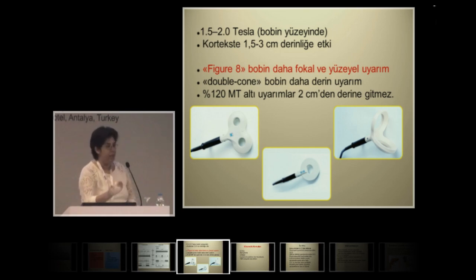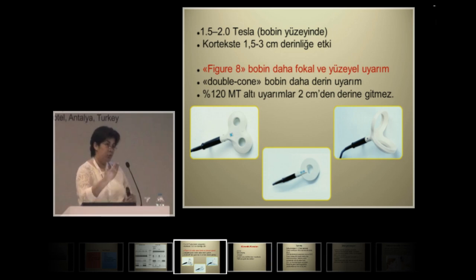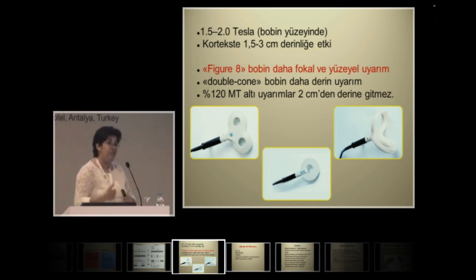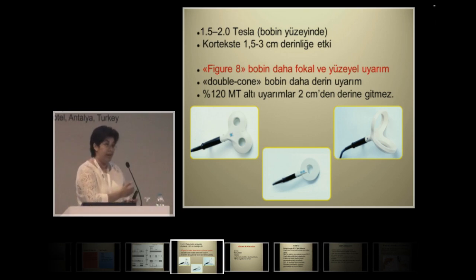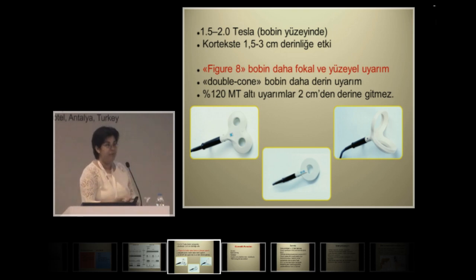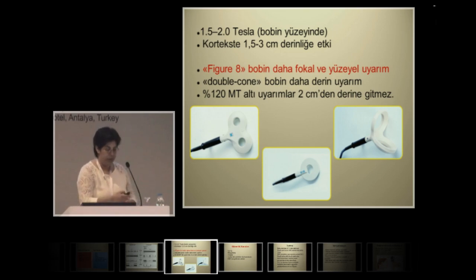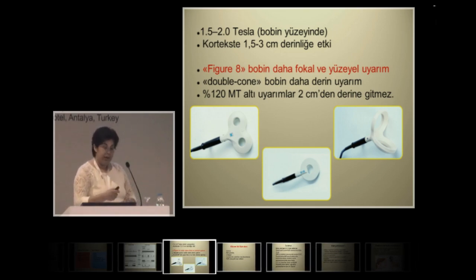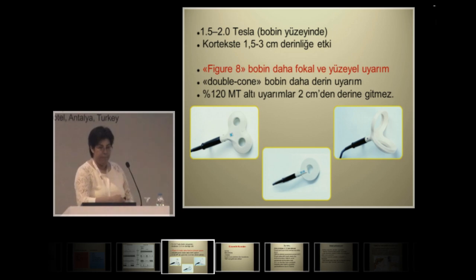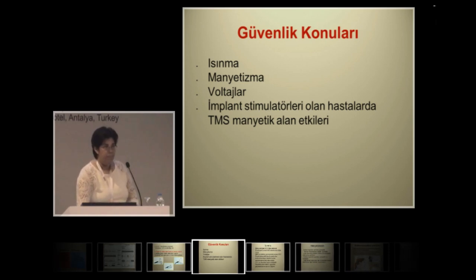This is about what kind of stimulus you need in order to observe a movement in your finger. You look at the strength, and then you provide a shock at a certain percentage. So if you deliver a shock that is 300%, and then independent from the frequency, the procedure becomes unsafe. So these are the parameters that have an impact on the safety of the procedure.